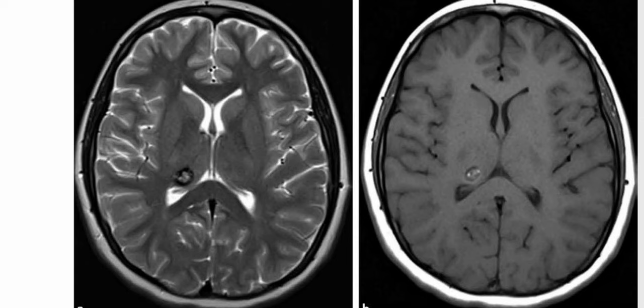So there's a peripheral rim of hypointensity surrounding a central lesion of hyperintensity. The alternating signal intensity results in a characteristic popcorn appearance. However, there is no mass effect or edema. The T1 weighted MRI shows similar but much less pronounced signal characteristics with central increased and peripheral decreased signal intensity.